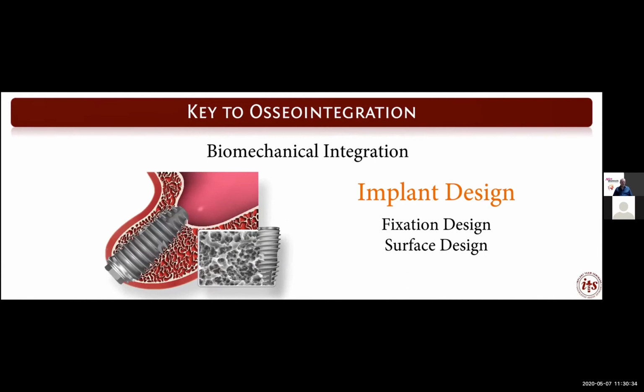What is the key to initial biomechanical integration of the implant that's going to lead us to osseointegration? We're going to take these 3 concepts of design, implant design, fixation design, and surface design to explain the importance of each.